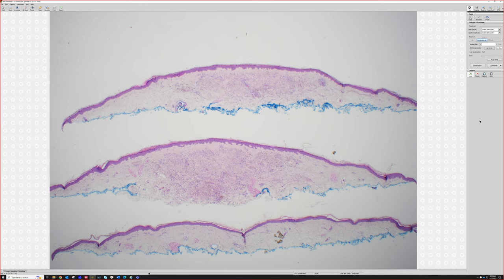From low power, I like your point that one of you made about could look like DF, because at the periphery, it often trickles out and traps collagen, just like a dermatofibroma does. Oh, and dermatofibromas and blue nevi both have pigment, but the pigment is different. In blue nevi, it's melanin, and in dermatofibromas, it's almost always hemosiderin. Now, from here, it's not possible to tell those two apart.